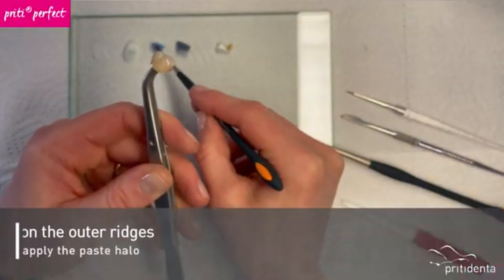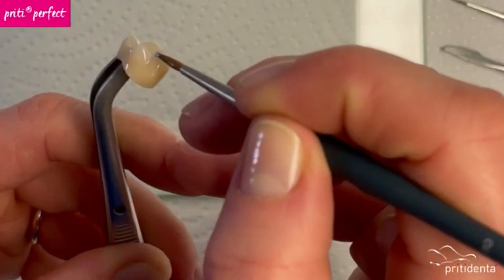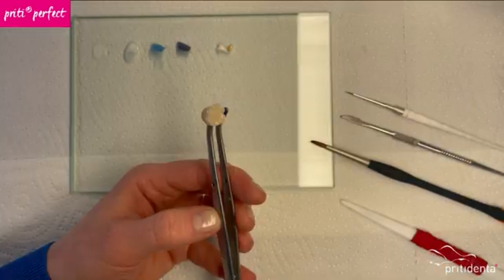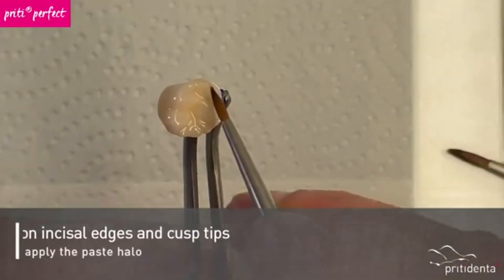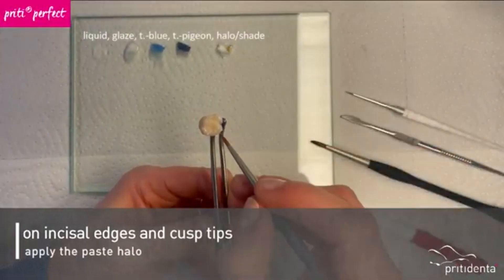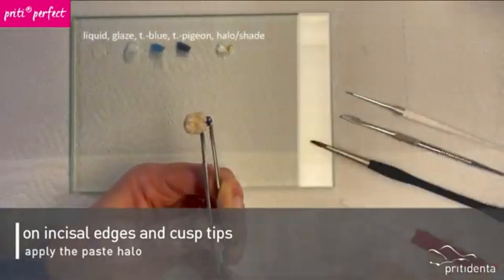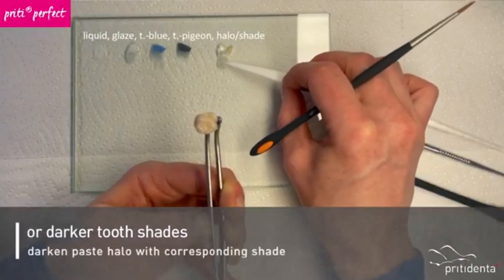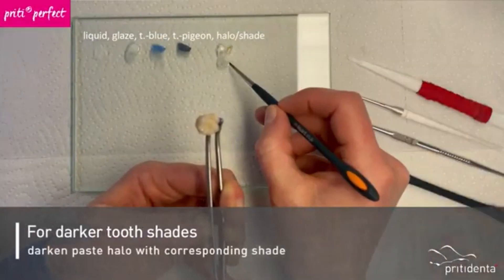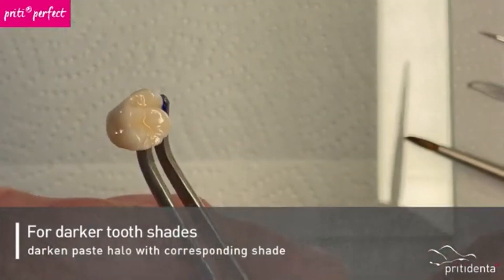I also apply a little transfer blue to the outer ridges. Finally, I apply some halo to the incisal edges and cusp tips. For darker tooth shades, you can darken the halo paste a little with the appropriate shade. For an A4, you would use shade A to adjust the intensity of the halo line.